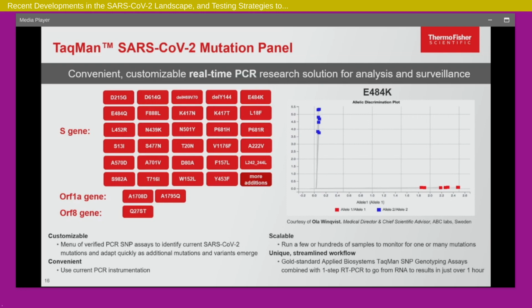The advantage of this system is that we obviously keep adding to this menu, but you can adapt it very quickly based on which strains are prevalent in your region. There's a website called outbreak.info, and you can go to that web page, and it tells you the prevalence of strains. It comes from the Scripps Institute for the last 60 days in your region. It also has a nice way of putting in all the variants of concern, and any other strains that you want to add in there. And it tells you all the mutations.